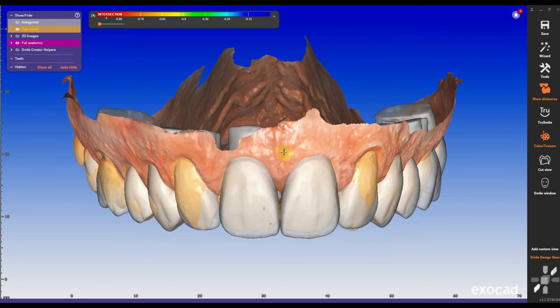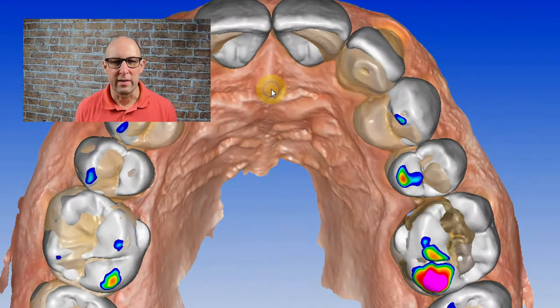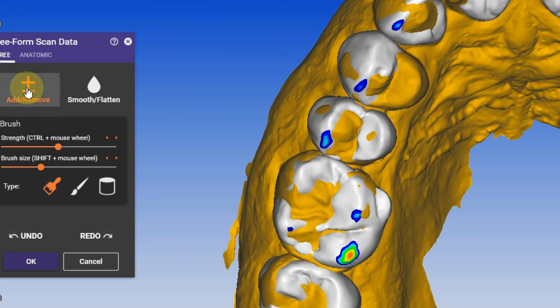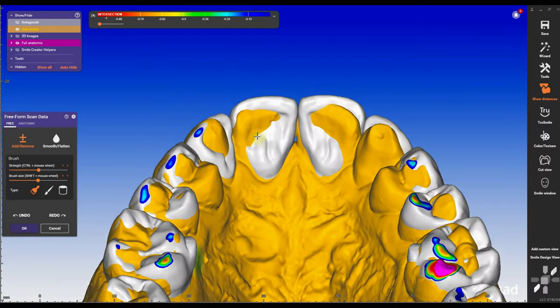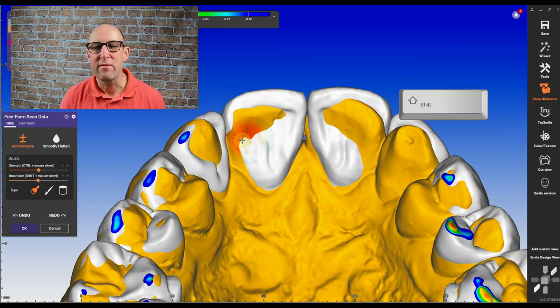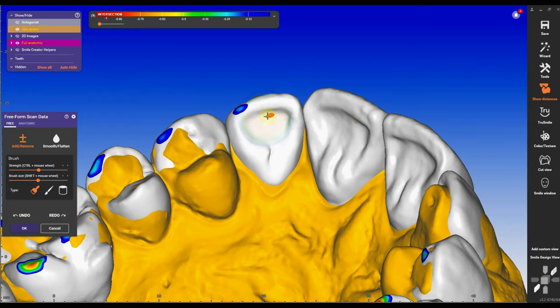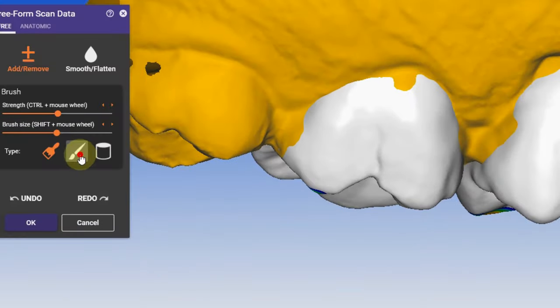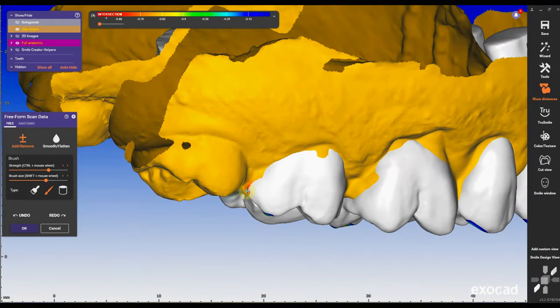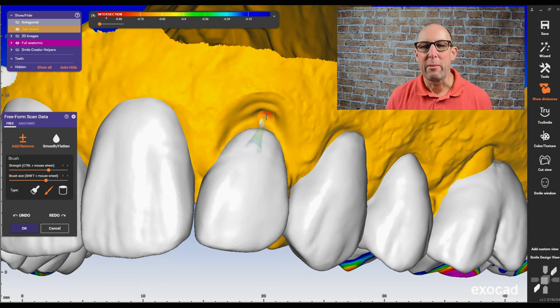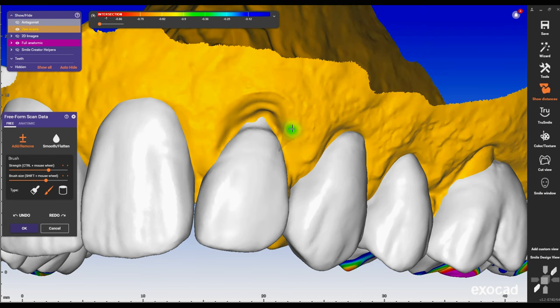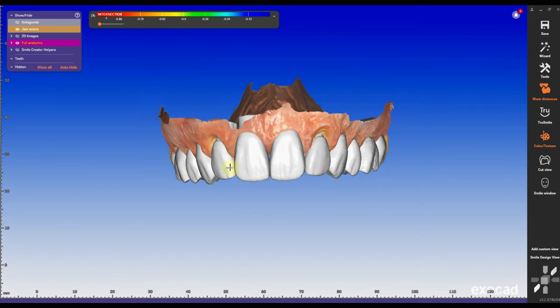Then what I'm going to see here is that I probably need some gingivectomy — you can look at my video about gingivectomy, I have a really detailed video. Then right click on the arch, select freeform scan data, select the plus sign under free and hold the shift button. That will get into the minus or reductive mode and you can take away the actual scan data where the arch is penetrating the new design.